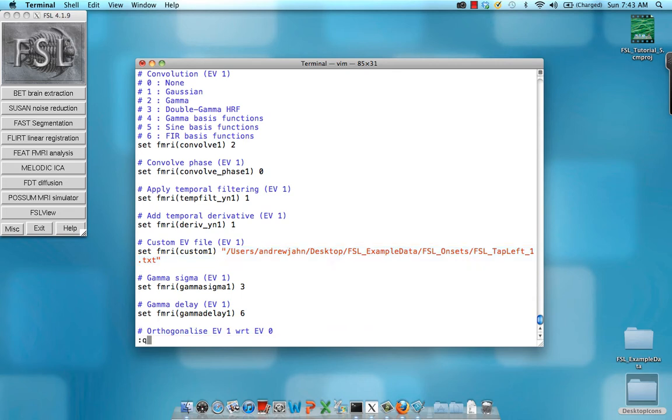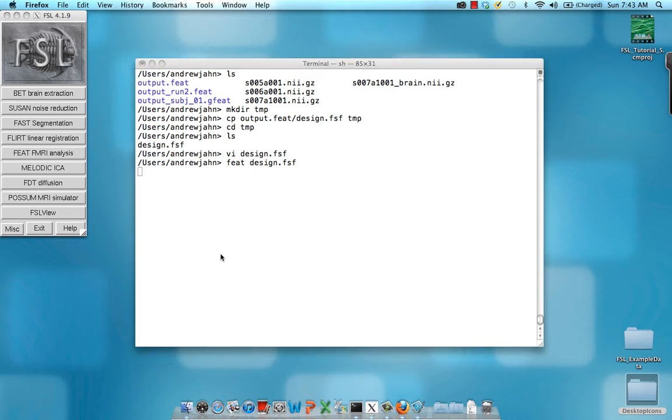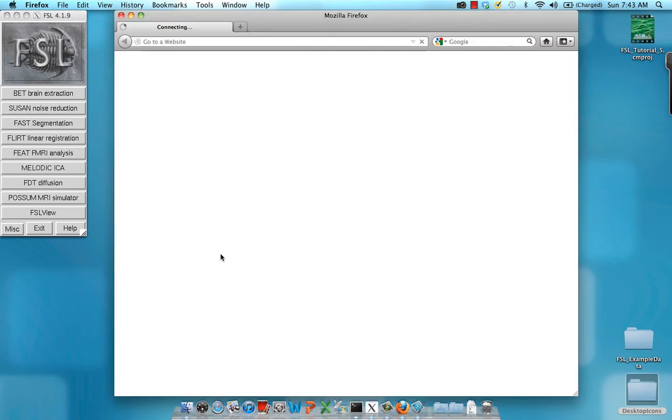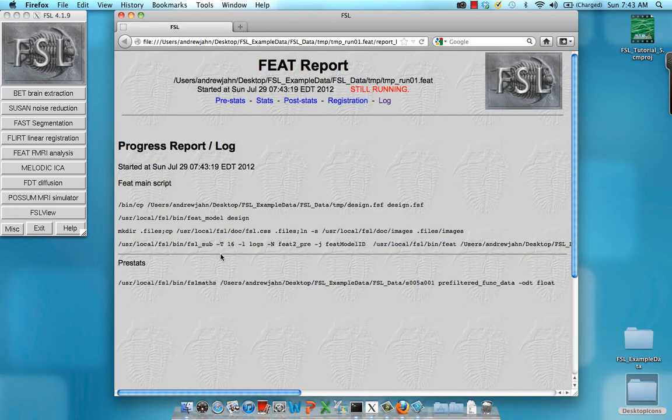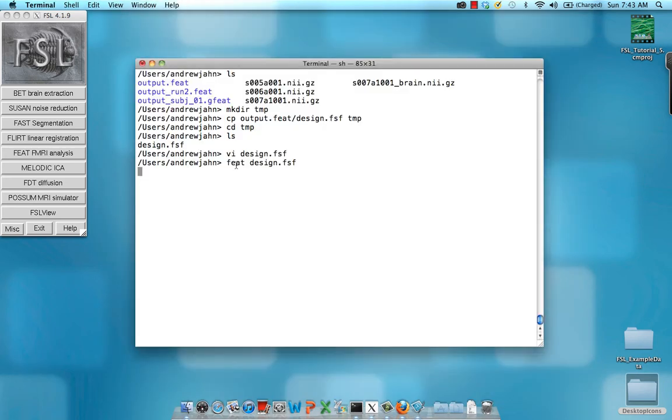But for now, if you want to execute a design.fsf file, just type in feat, that's the command space design.fsf. So now you hit enter, and as it goes, you can see it does the exact same thing as we did the first time when we ran it from the FSL GUI. I'm not going to have the whole thing run, but just be aware that it's there.